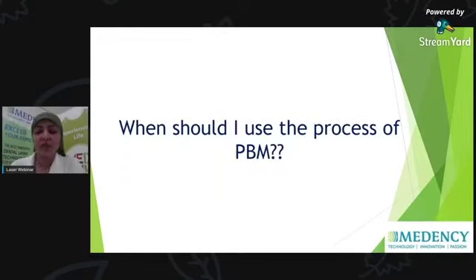Okay, when should I use the process of photobiomodulation? Photobiomodulation is for accelerating the wound healing. Also, as I said in the previous slide, it is a low-level laser therapy. So you are not using high powers. You are using a low-level laser power. So I can use it in wound healing. I can use it to relieve pain the patient is suffering from. Many of the patients come to the clinic complaining of pain, TMJ disorders, and they are feeling pain in this area. So you can treat them while using photobiomodulation handpiece within the laser device.